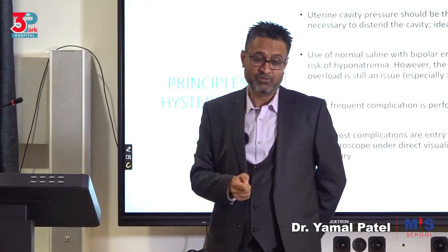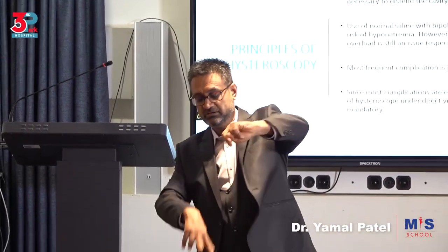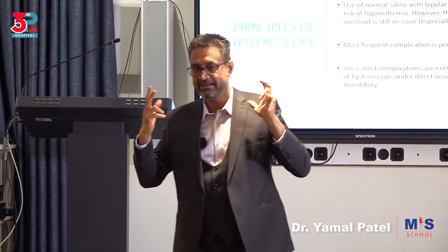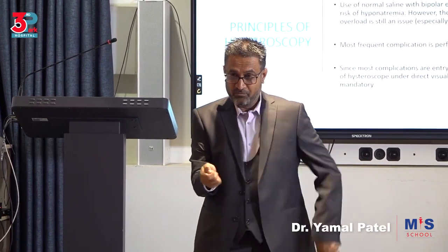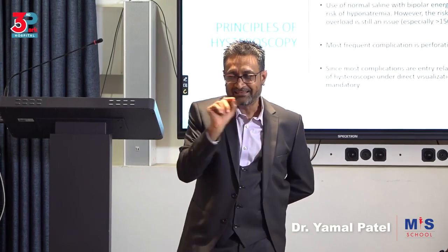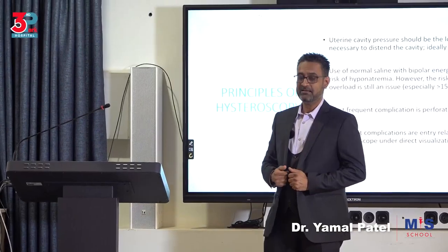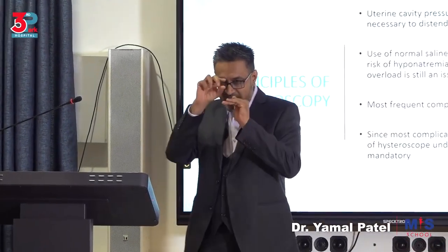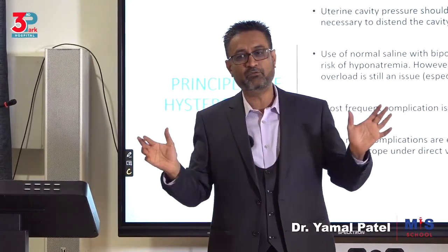Normally, we do surgery with traction, counter traction, cut, pull, stretch, cut. In hysteroscopy, one hand is just holding the view, but one is cutting. You get what I'm saying? So it's a bit tricky. Hysteroscopy is more difficult than laparoscopy, by the way. And it's also more dangerous because the error margin is very tiny. You can easily complicate very quickly.